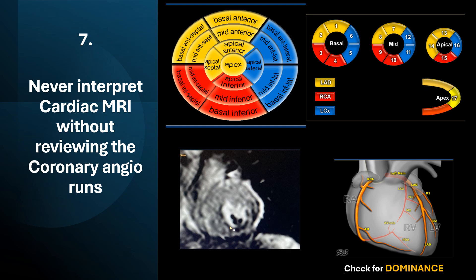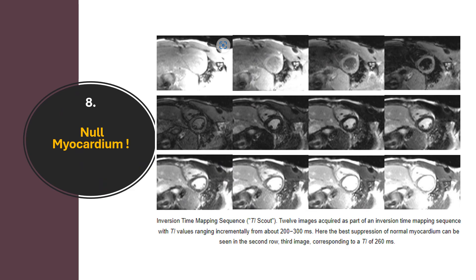The concept of null myocardium: to detect enhancement, the heart must appear extremely black so any enhancement stands out. These are null myocardial images — in this patient the null time is around 260 ms, usually between 200 to 300 ms. If not properly nulled, images like this result — even if enhancement is present, we might miss it. The look-locker sequence is run before late gadolinium enhancement images, between your perfusion and LGE sequences, each time contrast is given.